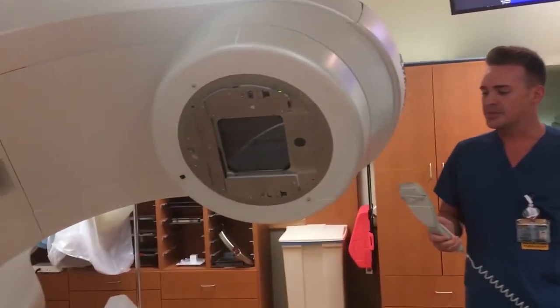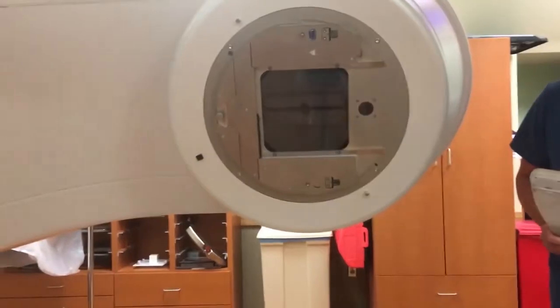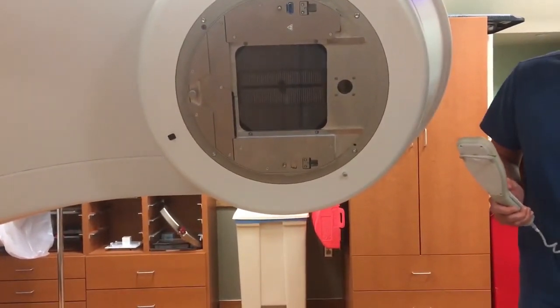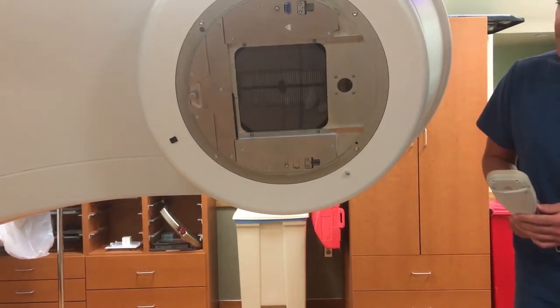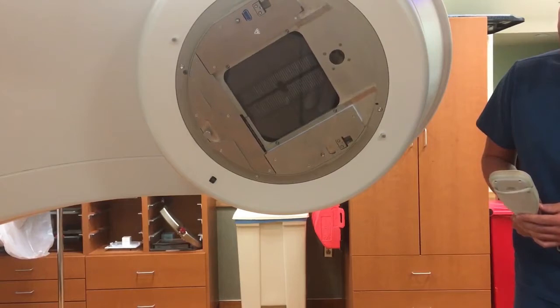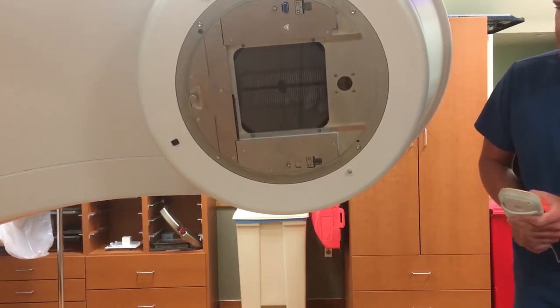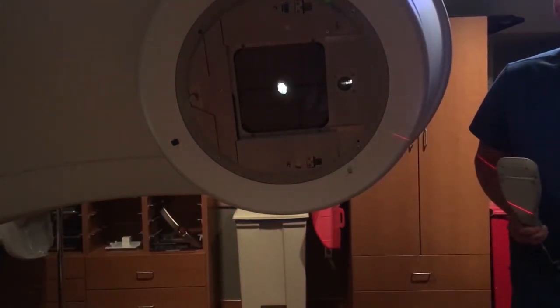As the gantry is getting in position, we'll be able to see one of the features we use to help shape the radiation therapy beams, or what's called MLCs, or a multi-leaf collimator. As you can see, the collimator can rotate around, and the MLCs are inside, which would shape the beam to such fields like this.